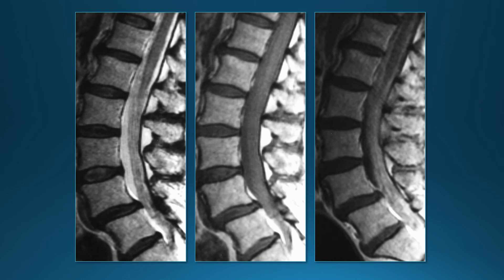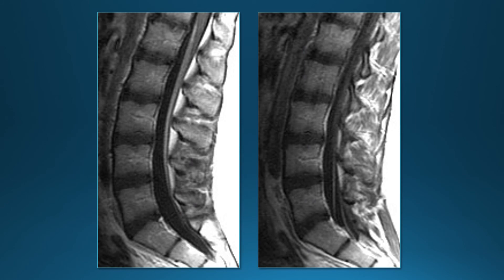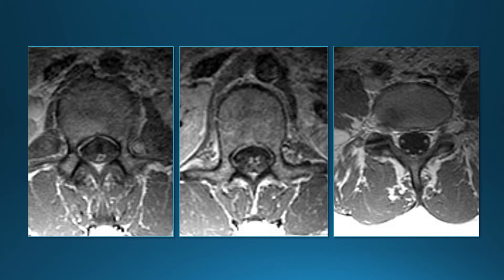Leptomeningeal disease can have a number of different appearances. In one patient, post-contrast images show enhancement of almost the entire subarachnoid space — the conus appears darker compared to the enhancing CSF on T1. Another pattern is more linear enhancement along nerve roots, which can be seen nicely on axial imaging showing the enhancing nerve roots.